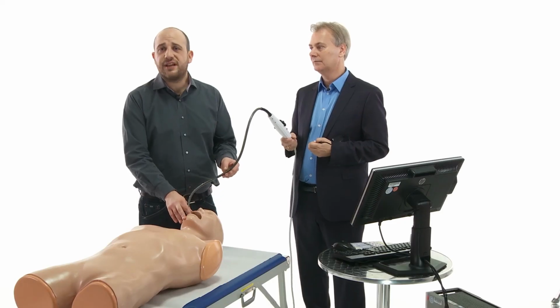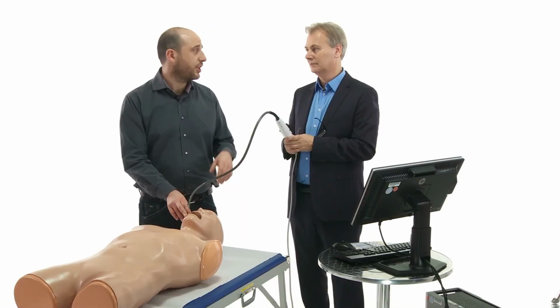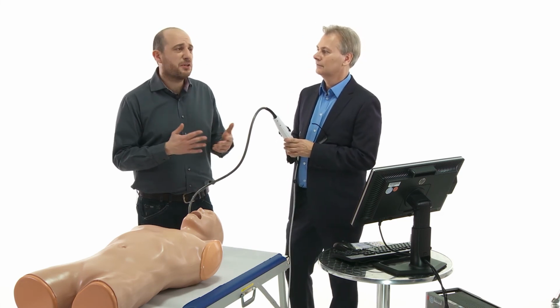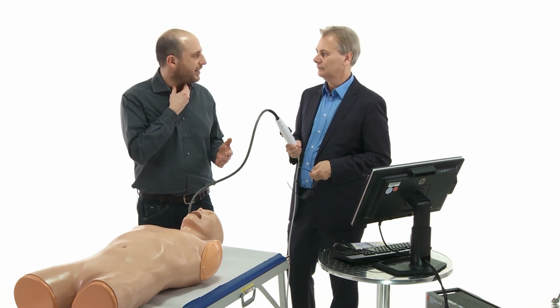I would suggest at the beginning to insert the TEE probe with the laryngoscope. You will minimize the damage to the pharynx. You can have some problems, especially in our patients, with coagulation, and it could be very bad to have big lesions of the pharynx. For the normal patient, naturally, it is a discomfort. After the examination, they will feel some pain. So this finger could help when you have some experience. Instead of this, you can use a normal laryngoscope.